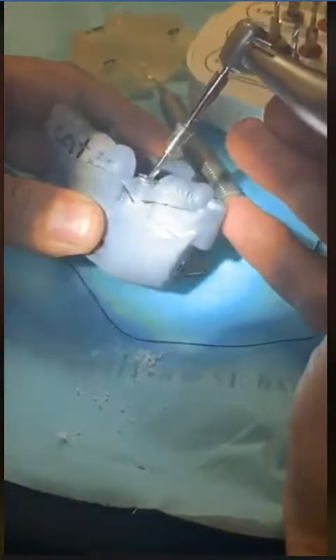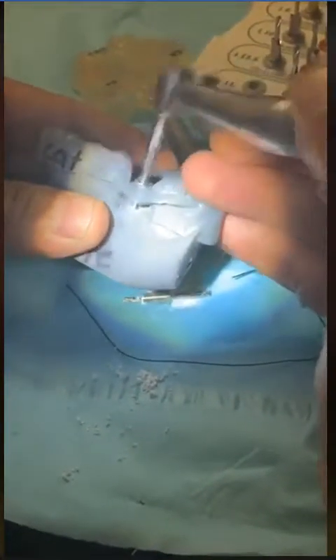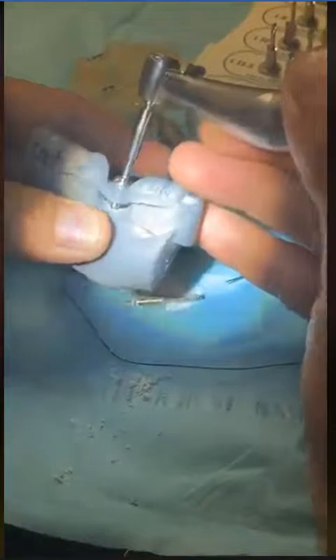So then, after we're done with that burr, now we're going to put in the 2 millimeter pilot by 13. Now look what is going to happen here. The minute I put this in, it actually goes in further. Let me just take this extension.